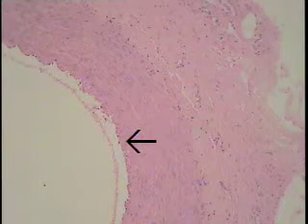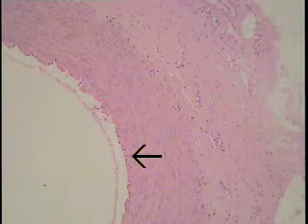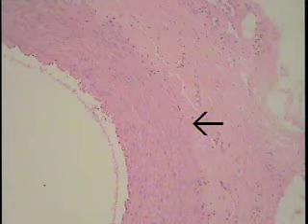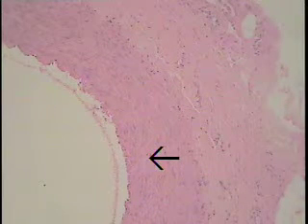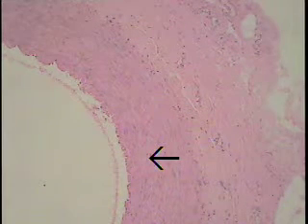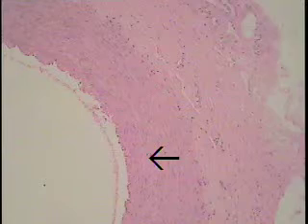Though difficult to see at this magnification, the intima has the 3 subcomponents we noted earlier: an endothelial layer, a subendothelial connective tissue, and a very prominent internal elastic lamina. The media is all smooth muscle. Then you have an external elastic lamina separating the tunica adventitia shown here from the tunica media and its heavy smooth muscle now shown at the arrow. So this is an example of a muscular artery, one of the major distributing arteries, like you're going to find in the majority of vessels in the legs and limbs, those distributing type arteries.